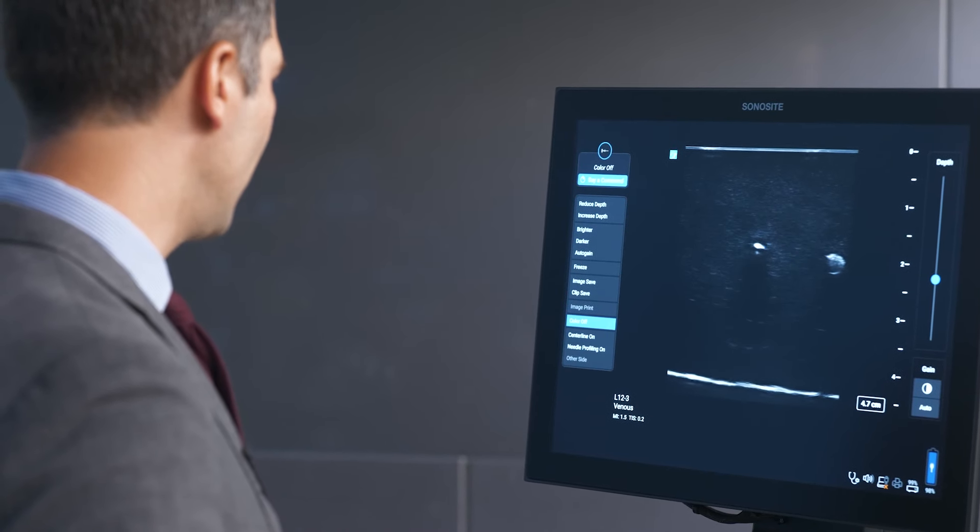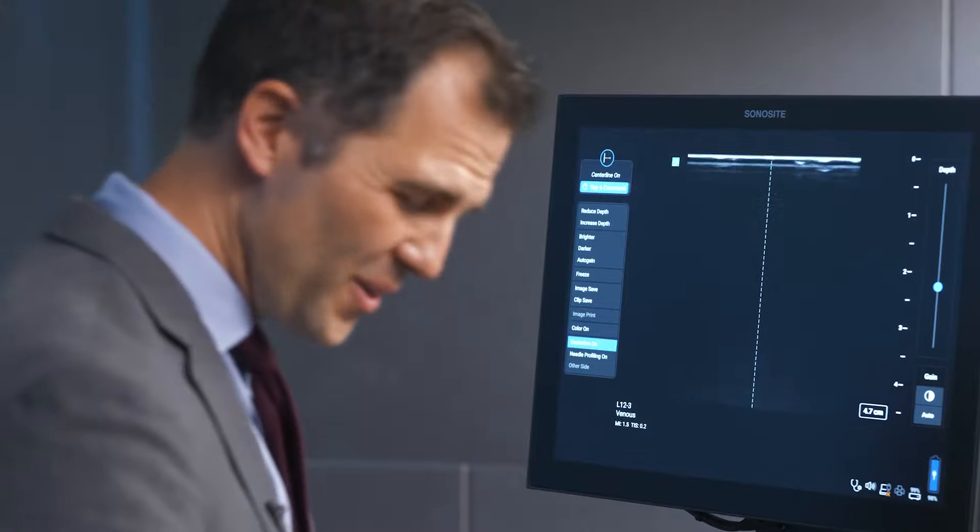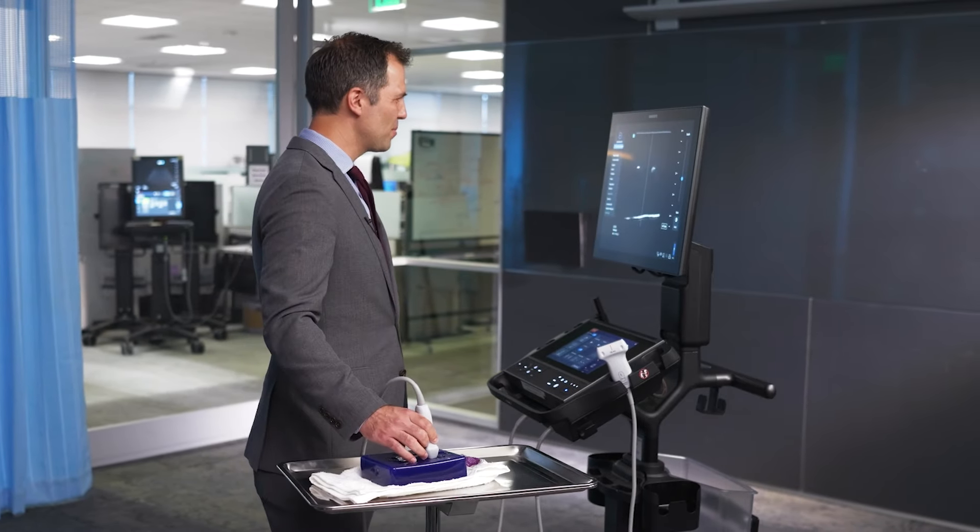Color off. Centerline on. Whoa, okay. That's super responsive.